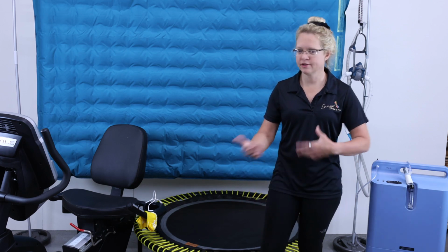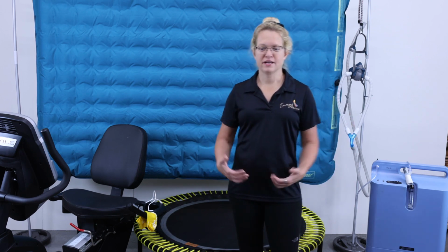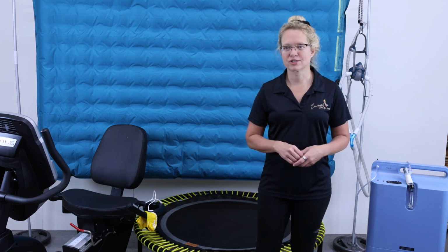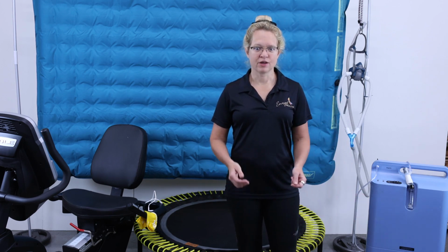You don't need to spend $2,000 to $3,000 to buy a special EWOT system if you don't want to. If finances are tight, like they typically are for me, it made a lot more sense for me to build my own system. So this is my home personal EWOT system, and I'll explain how I put it together and why I chose the components I did.